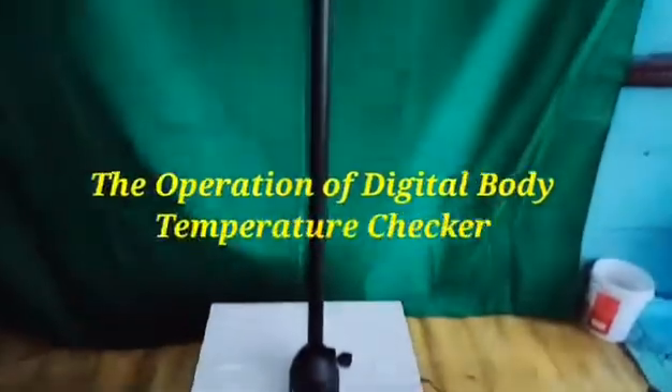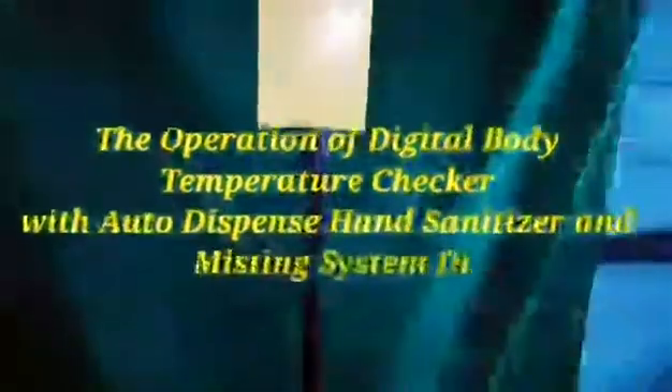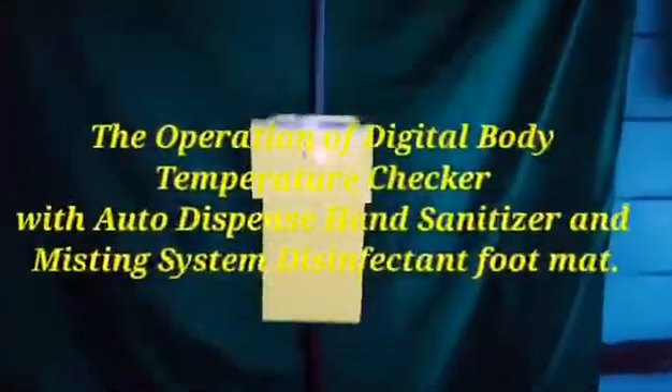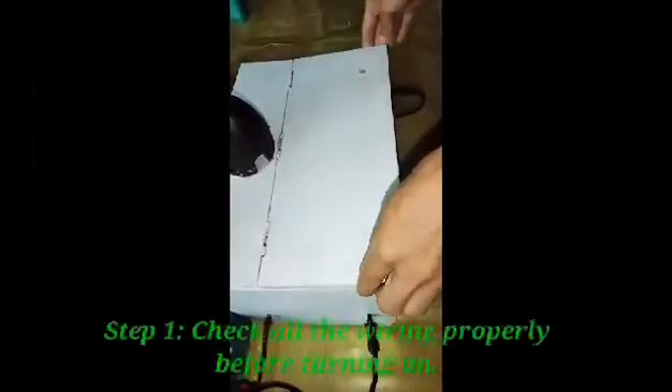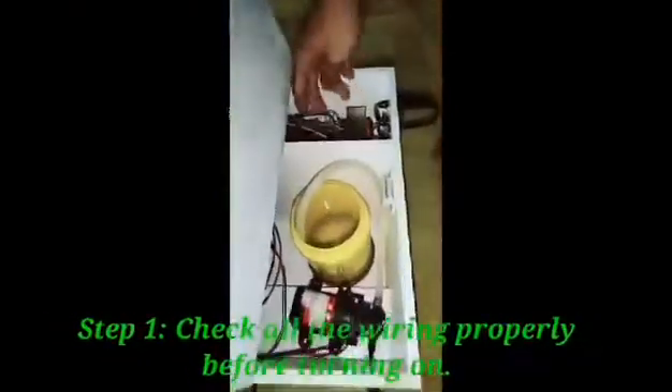This is the operation of the Digital Body Temperature Checker with Auto-Dispense Hand Sanitizer and Misting System Disinfectant Footmat. First step: check all the wirings properly before turning on.